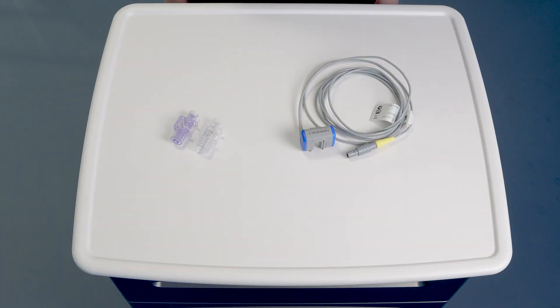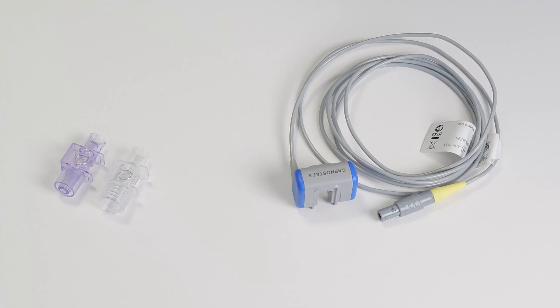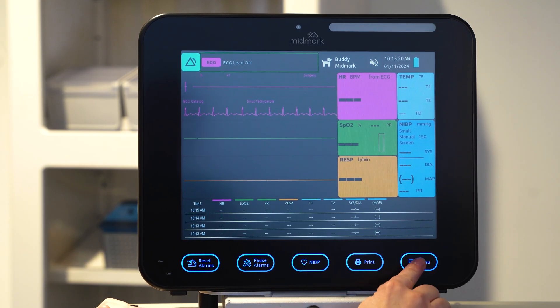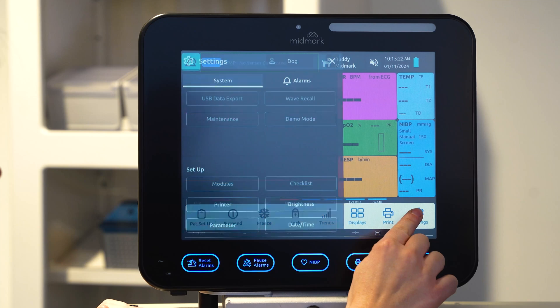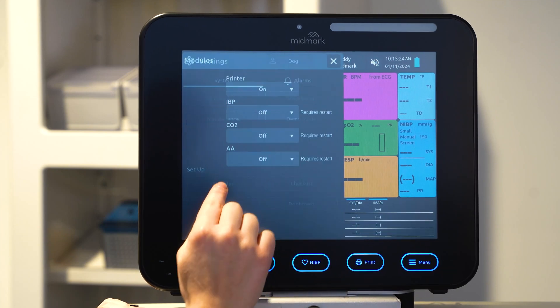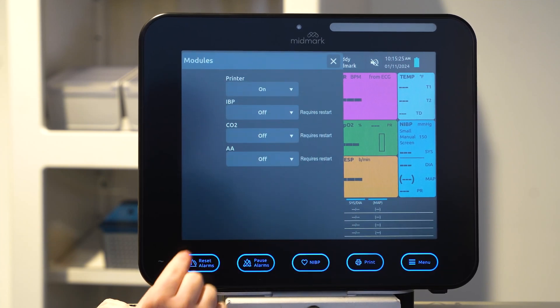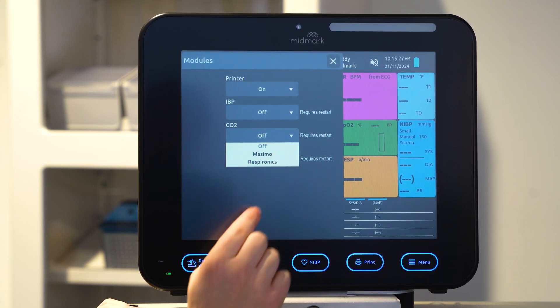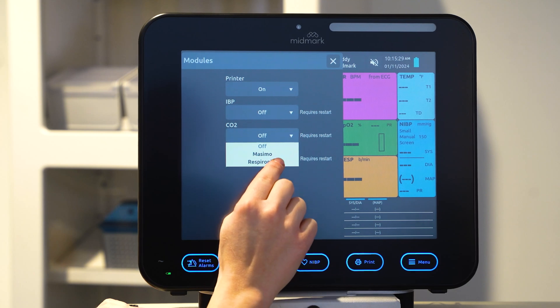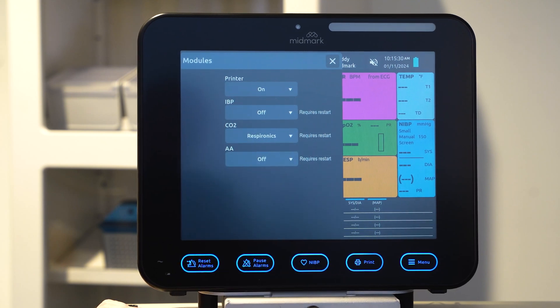If a CO2 module was purchased, it must be activated and zero calibrated in the menu. Press menu, select settings, select modules, expand the drop-down option next to CO2, and select Mossimo or Respironics.